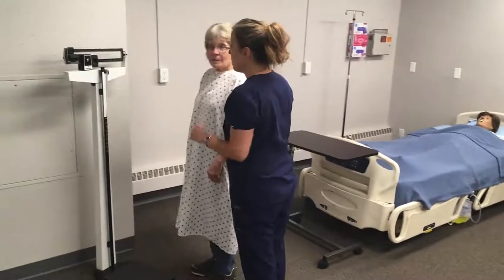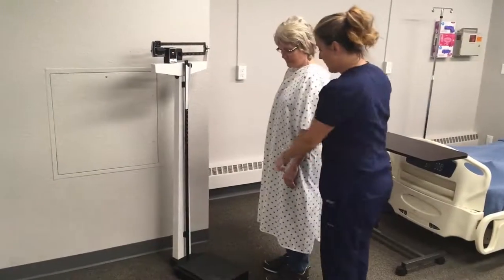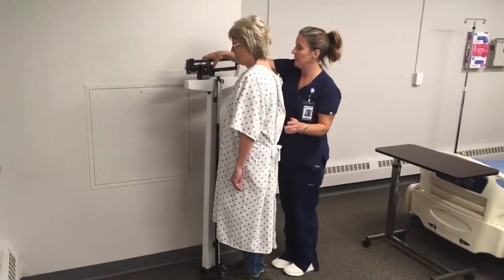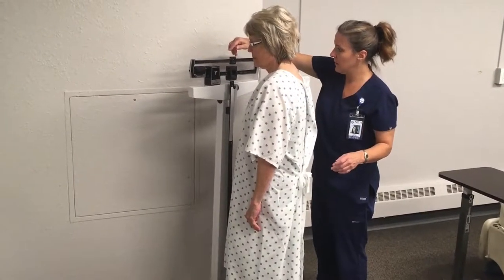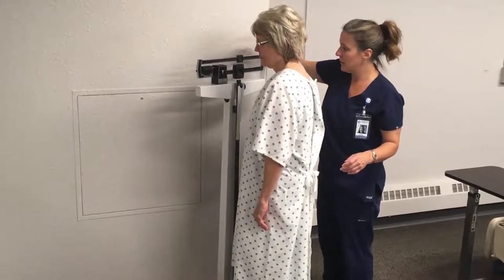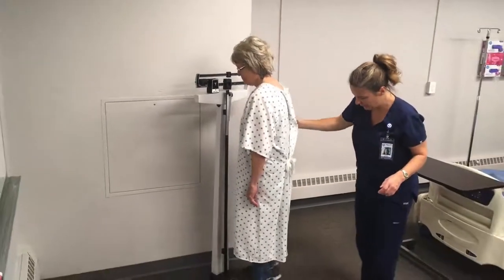Let me make sure the scale is set at zero before you get on. It is. Will you please step up on the scale for me? Make sure it balances. Will you please step off the scale for me?